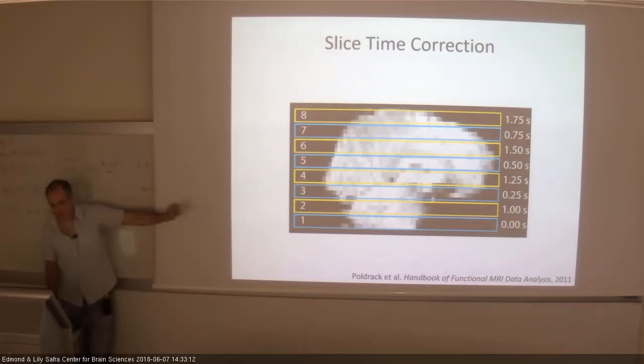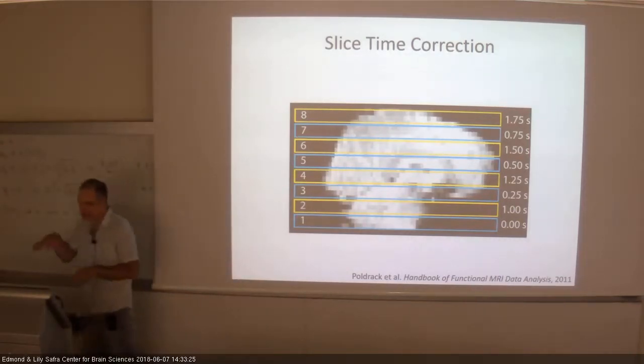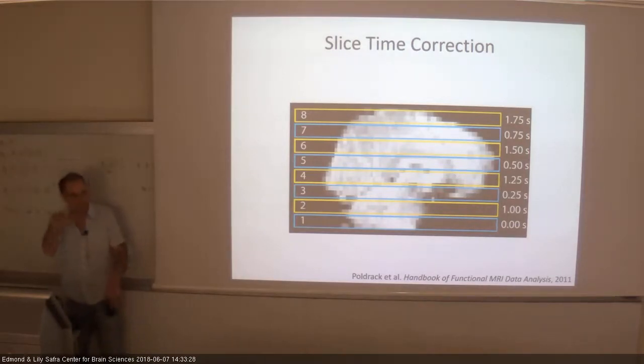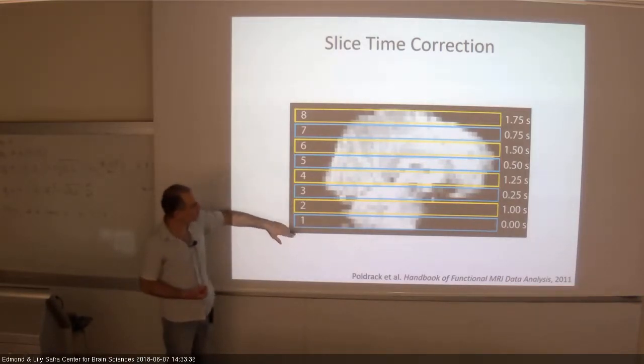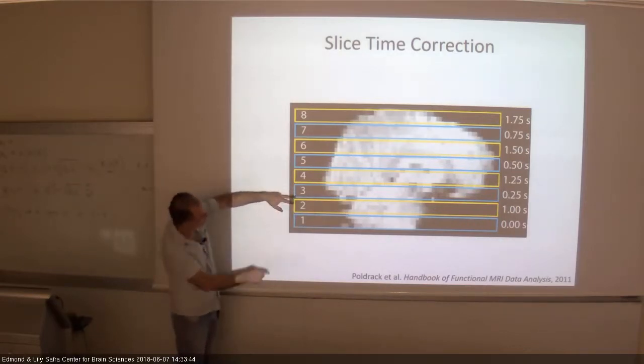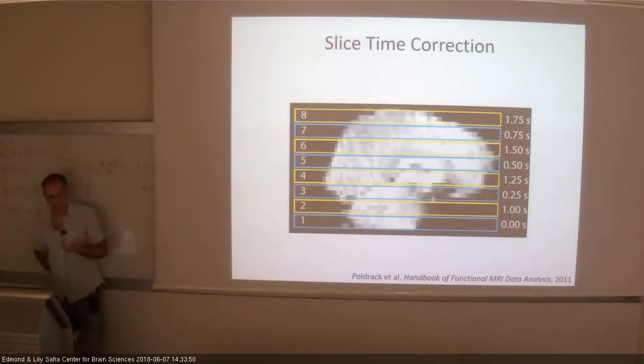TR, right? So this is the time unit in which we cover our whole selected brain. It could be the whole brain or just part of the brain, but this is our time frame, and we have to work under this limitation. And what do we do in this time frame? We slice the brain, right? And we cover the whole box that we selected. We usually do it to escape some other artifacts, in an interleaved fashion. So this is scanned first, and you see by the seconds there, we go 1, 3, 5, 7, and so on and so forth. But that creates a problem.